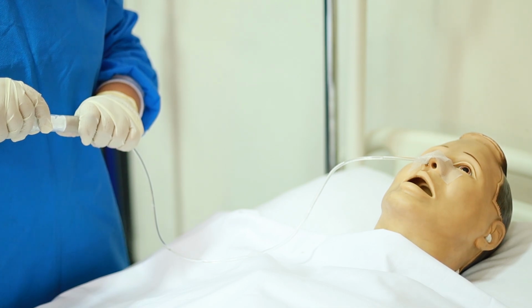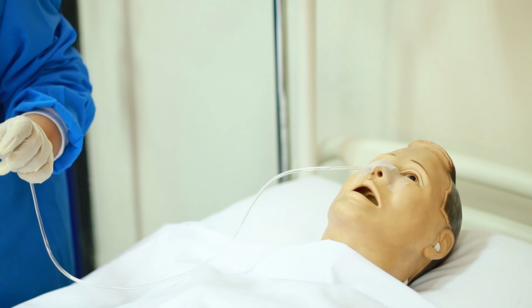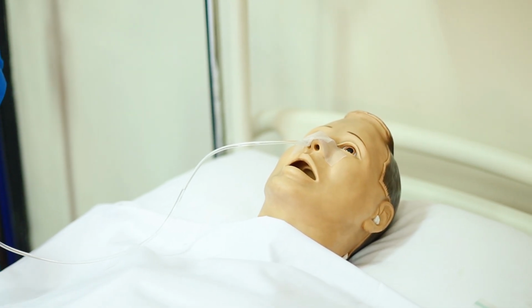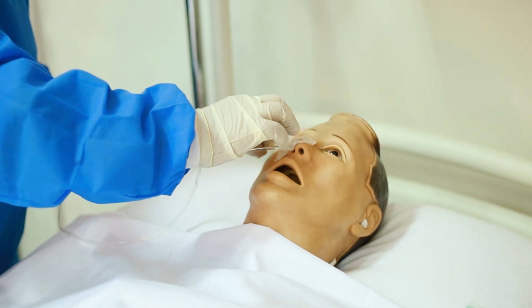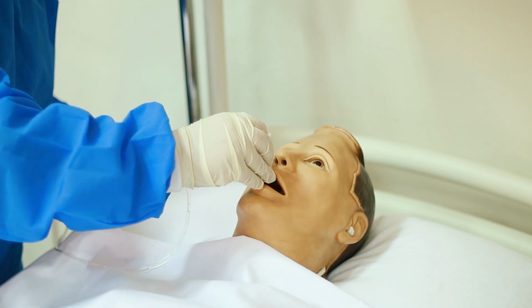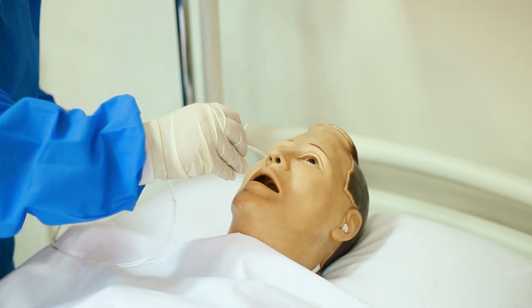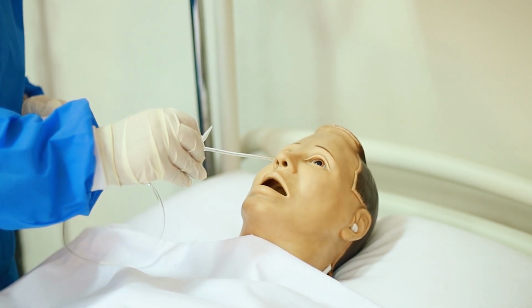Dear students, please remember this is for the adult patient. If there is a child, make it 5 to 10 ml. Then remove the adhesive tape. Rotate the tube to assure that it is moving freely, then pull slowly and steadily and remove the nasogastric tube.